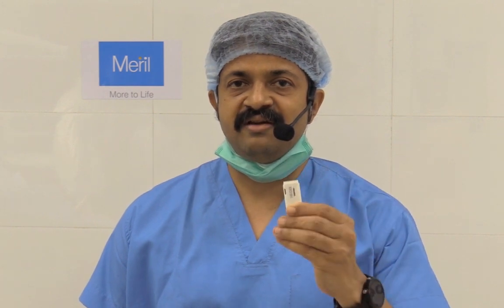Upon admission of the patient to the hospital, we do run a CT scan, which is typically from femoral head to the talus. And in the critical areas of femoral head, the knee region, and the talus region, we do 1 millimeter slice thickness. In between, it could be 5 to 10 millimeter slab thicknesses. The entire CT scan of the patient is archived on a pen drive.